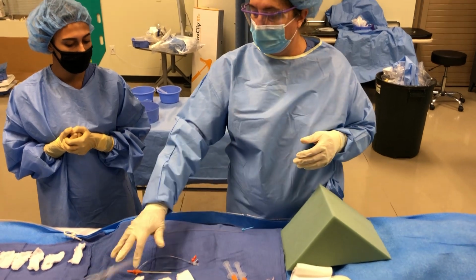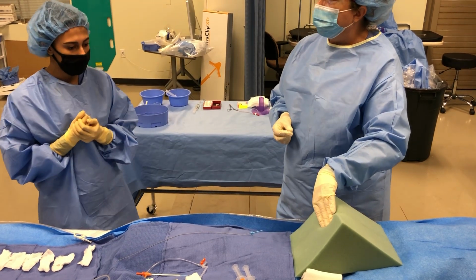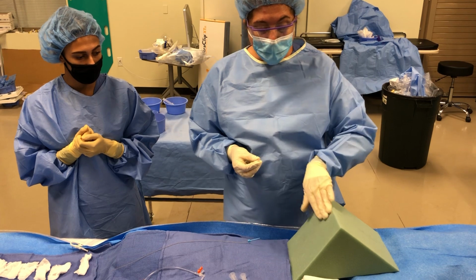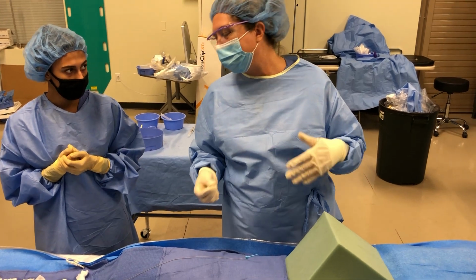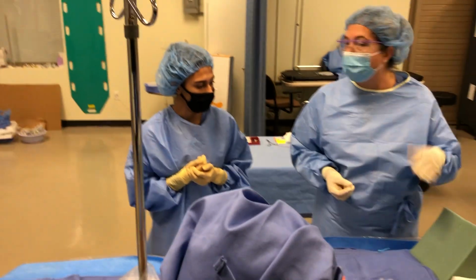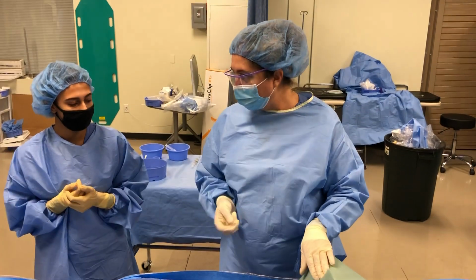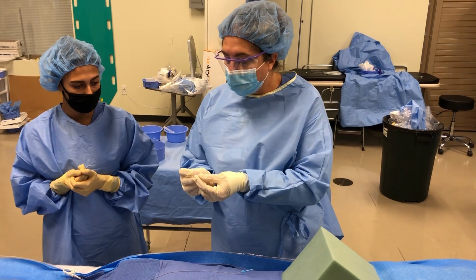Okay? Next step is my access. Some doctors are maybe gonna feel just a little bit. A lot of lidocaine can obscure the pulse a little bit. So if it wasn't a great pulse to start with, then they may have a little bit harder time feeling it. Also, the more conscious doctors are going to try to let that lidocaine work a little bit, like when you go to the dentist and they numb you up and then they leave the room for a little bit so that it works. Some of them don't do that and they just go straight and the patient still kind of feels stuff. Either way, they're going to have their percutaneous needle.